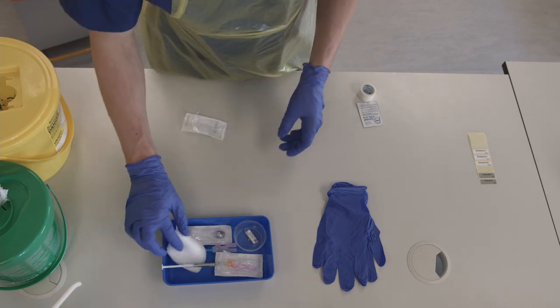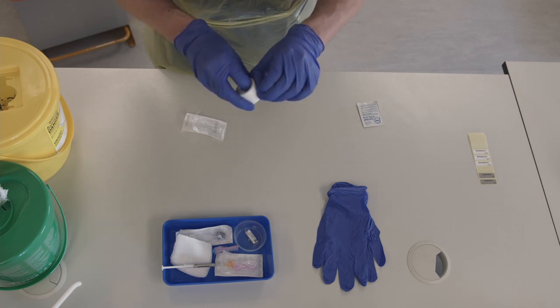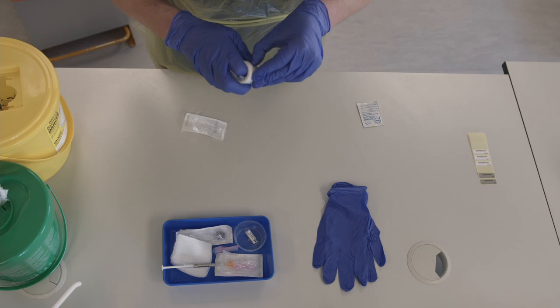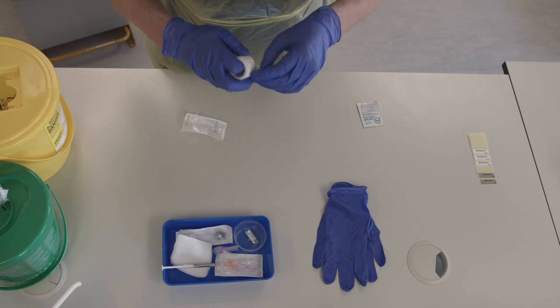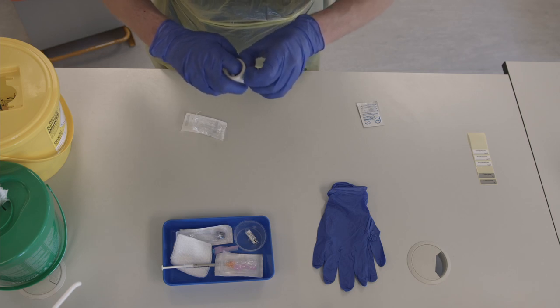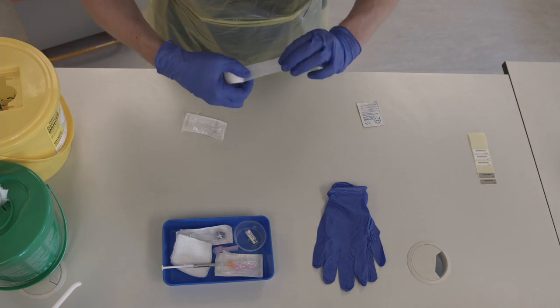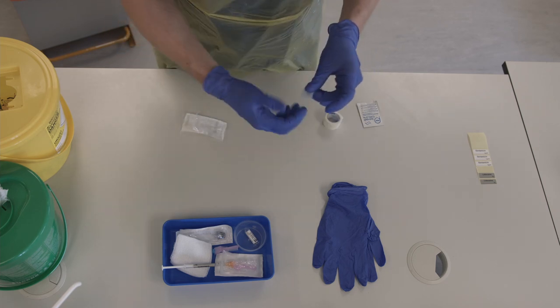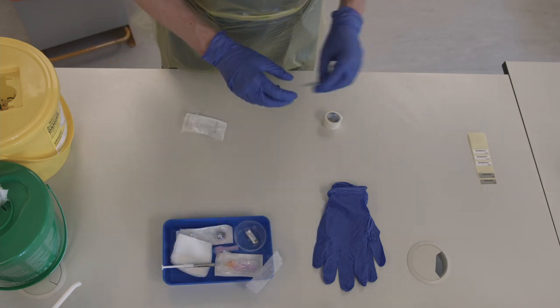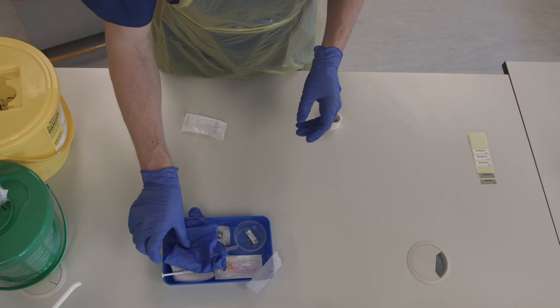Add gauze and a piece of tape. Finally, put a chlorhexidine wipe and a pair of non-sterile gloves in your tray.